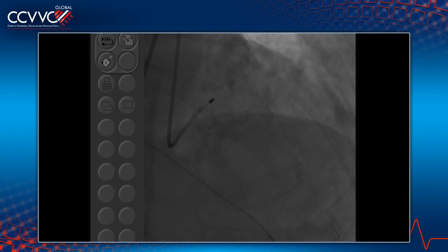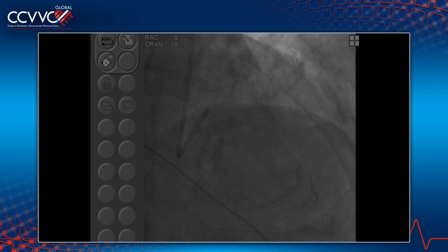It looks high here. Yeah, the coronaries look high enough, the sinuses look big enough. I wouldn't have done a valvuloplasty either. I would just have done the PCI with or without atherectomy. If the balloons may expand, would you not try them first? Keep it simple. Why not a valvuloplasty as Samin did just now?